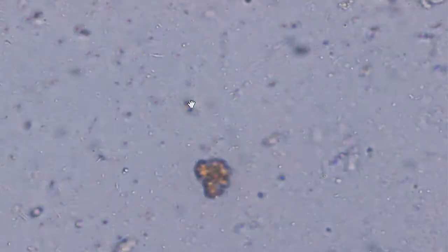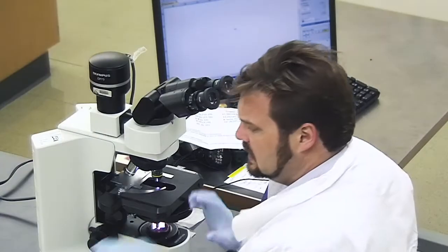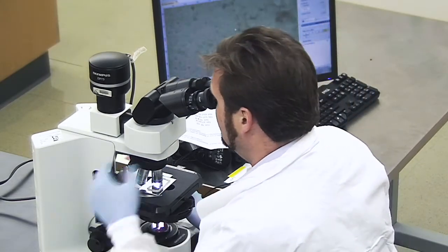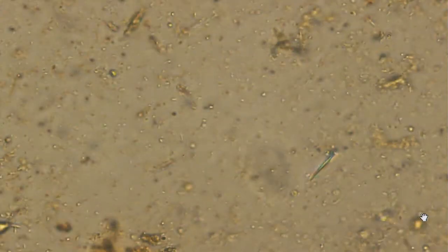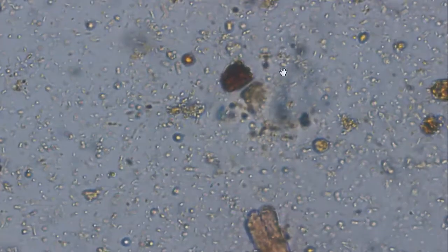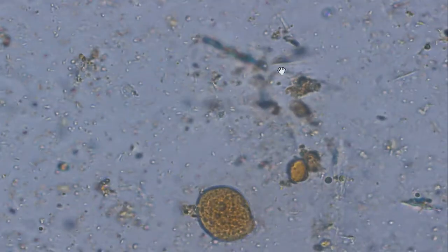So I, of course, would look through the entire thing and look for other parasites, but we don't have time for that. So what I'm going to do now is move on to the next in this list. I want to show you these same organisms now with an iodine stain. Now, iodine, or iodine as it's pronounced in the United States by a lot of people, can help with identifying the nuclear morphology. I'm just going to pull this into focus now and correct for white. And there we go. So why we use iodine is it can really sometimes bring out the nuclear morphology well.